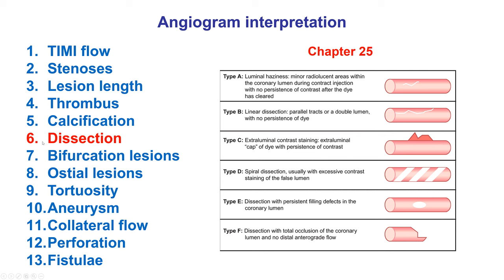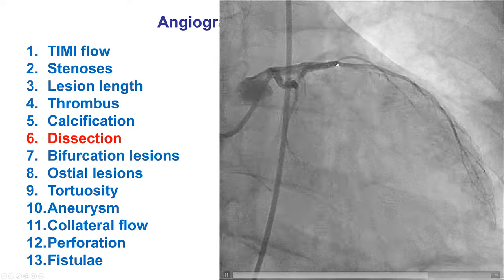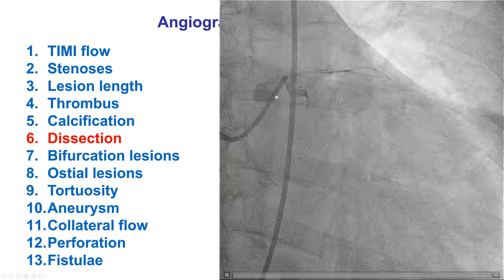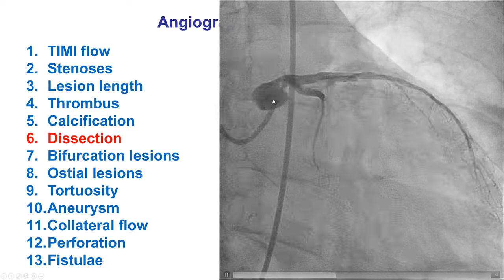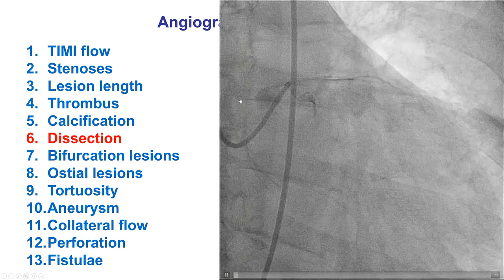Moving on, coronary arteries can have dissections that are either spontaneous or iatrogenic. There is the NHLBI classification of dissection severity, ranging from small luminal haziness to a linear dissection to complete occlusion of the vessel. This is an example of dissection in the LAD and circumflex, as well as aortocoronary dissection going backwards. This is why the pressure waveform should be assessed very carefully before injecting contrast, because injection against a dampened waveform can lead to coronary dissection.